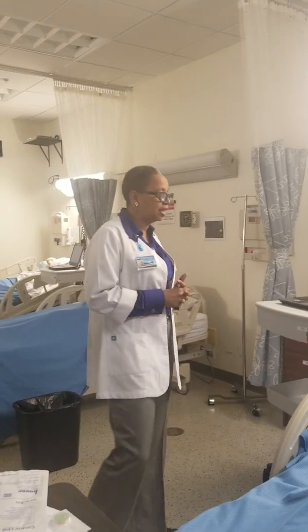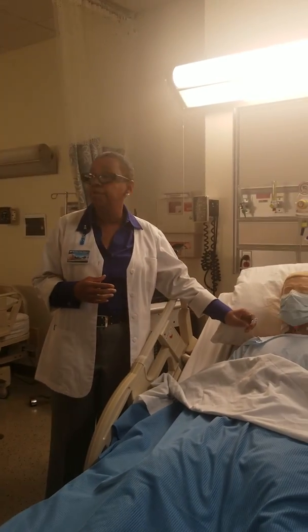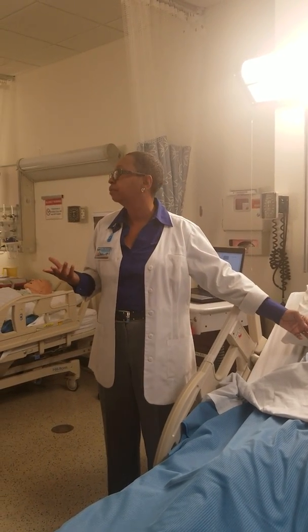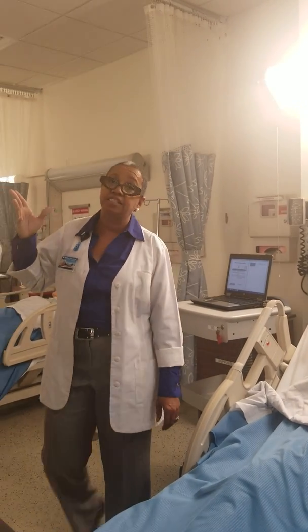What else? When was the last dressing change? Absolutely. So all that stuff I want to ask my nurse. I want to know, if they have a line, number one, how many lumens I got, okay? Because it's not very helpful to have a central line and have one lumen. But sometimes they will put in just one lumen. It's better if you have 2 or 3 because you have different access points, okay?